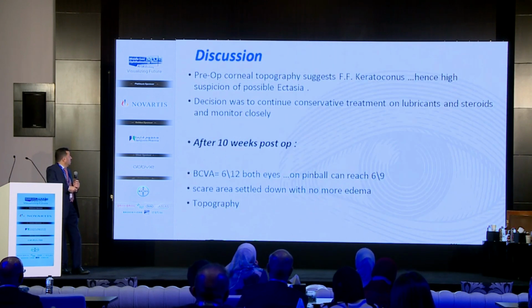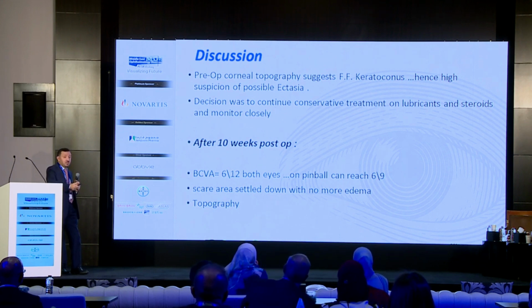So, in my opinion, this pre-op suggested some form of forme fruste, or at least a borderline cornea. So there is a possibility of ectasia, for sure. We will keep it in mind. So the decision was made to continue the conservative treatment with lubricant and steroids and monitor closely.